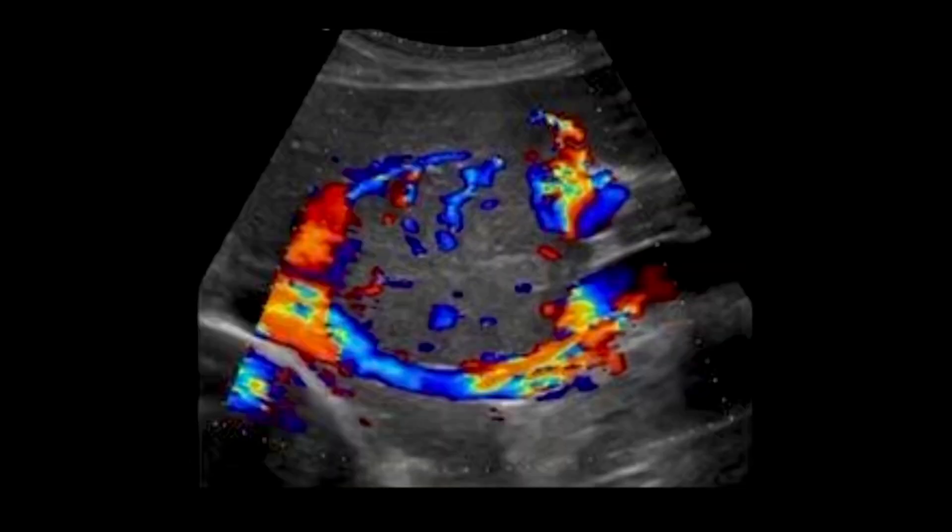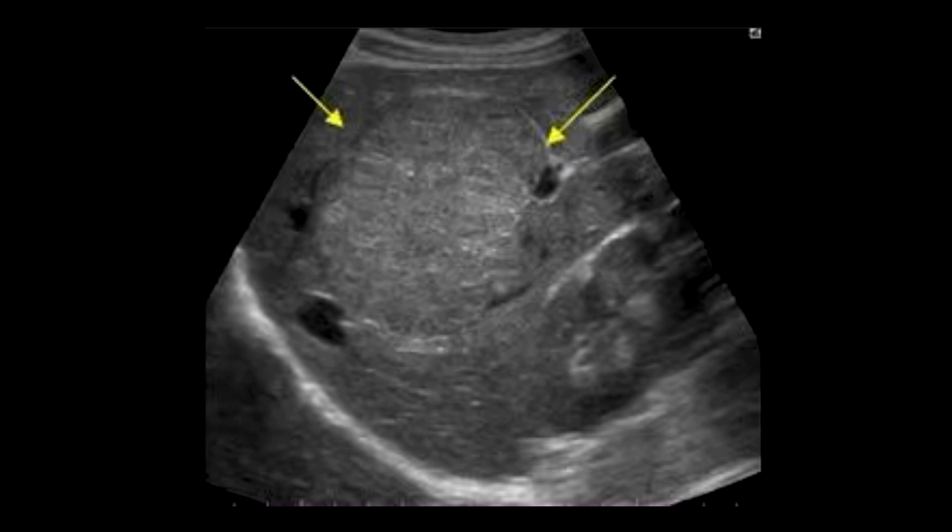The lesion does have some vascularity to it and a kind of spoke-wheel pattern. And here's a transverse image showing the mass again. It is clearly well-defined.